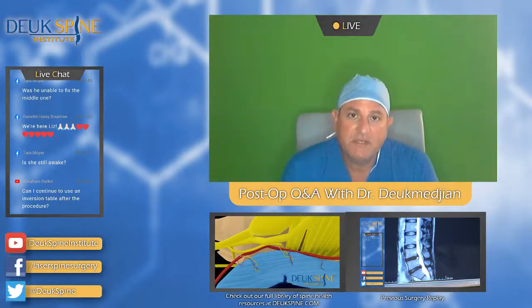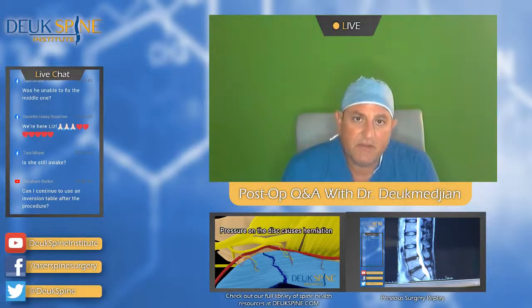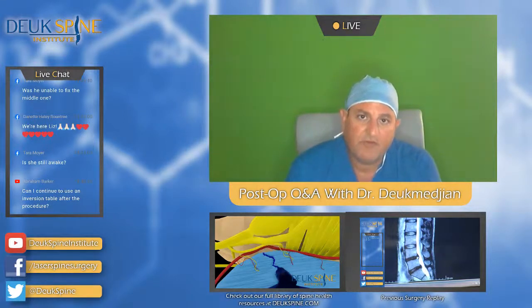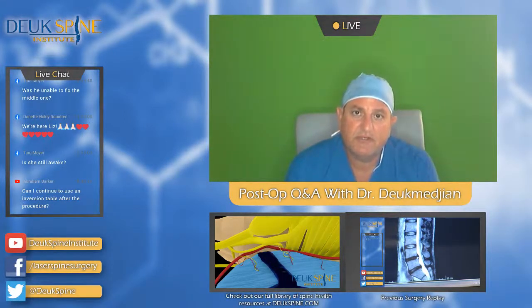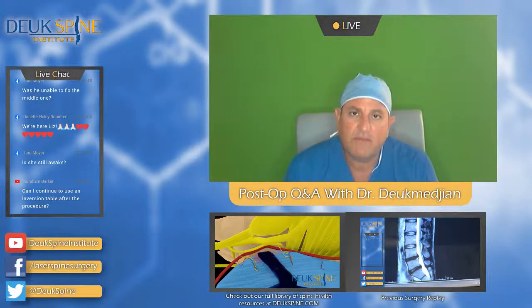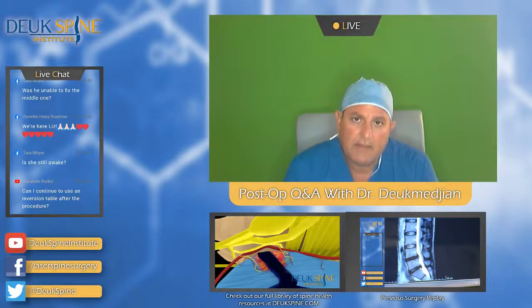Our patient had a lot done today. She had sacroiliac joint pain and facet pain on the left and at L4-5, L5-S1. She also had 2 degenerated discs, L4-5 and L5-S1, that we were able to fix L5-S1, but I couldn't get into the L4-5 disc. It was just too collapsed and too stuck down. And then we fixed the L3-4 disc on the right side.